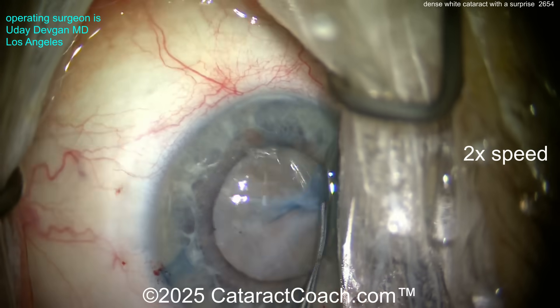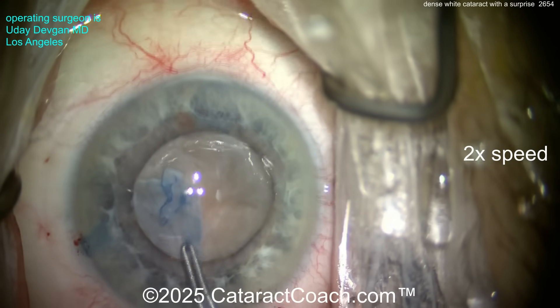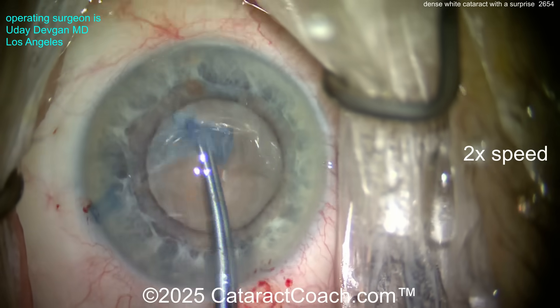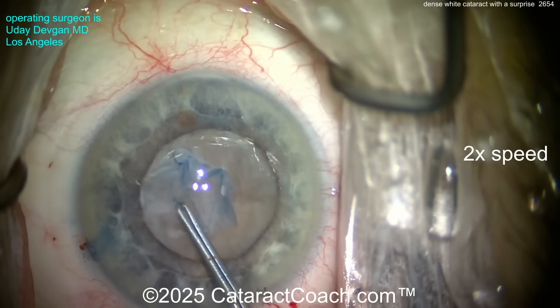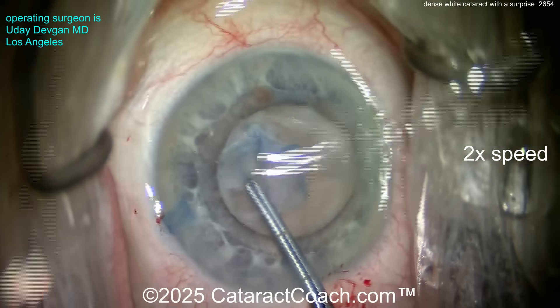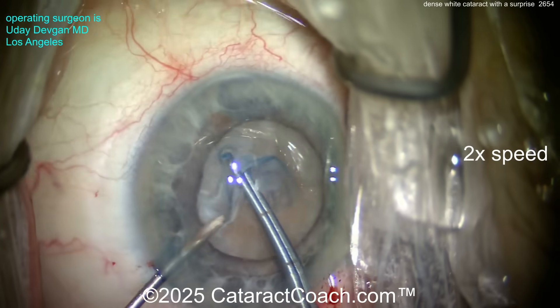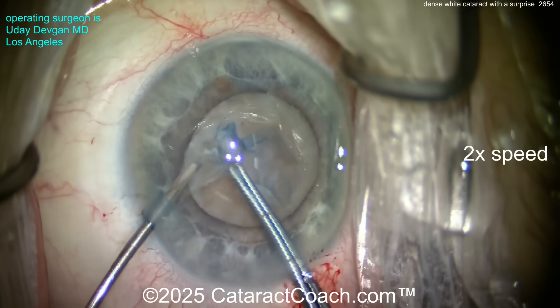Got a little opening — can we start tearing it? That's pretty reasonable. I want a nice large rhexis here; with this type of dense cataract I don't want a small rhexis. The rhexis is forming but it's not easy to tear, and at the end it's kind of just stuck. I'll use that cystotome again — just cut through these bands. Look at that thick fibrotic band. Cut, cut, cut.